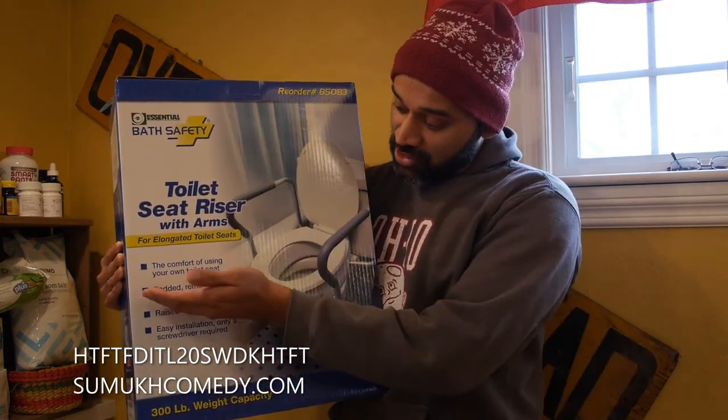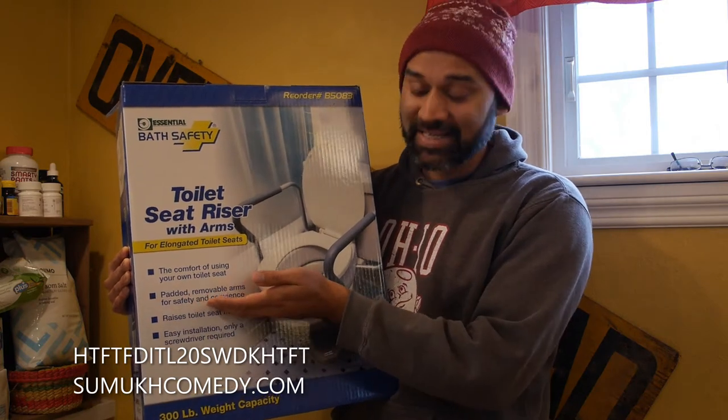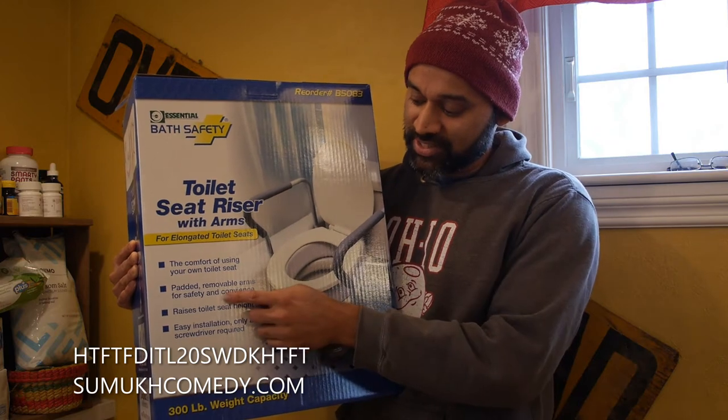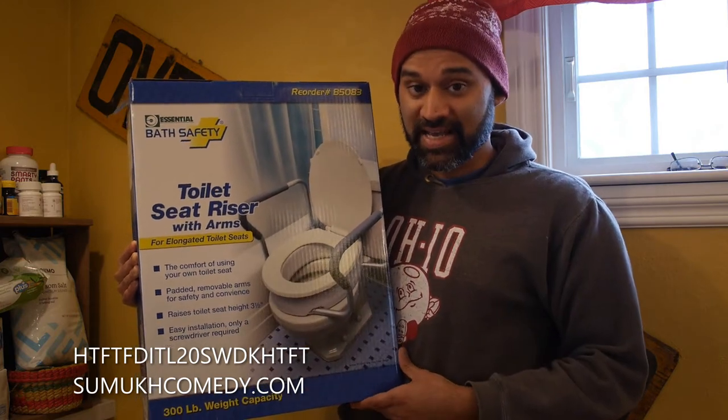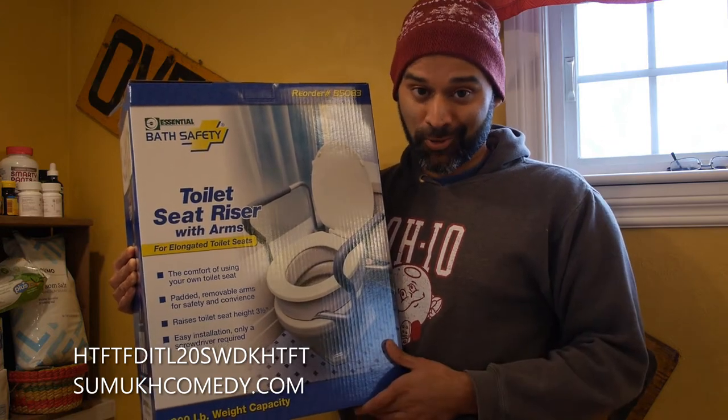As you can see, this is also padded and has removable arms for safety and convenience. But they seem to have spelled convenience C-O-N-V-I-E-N-C-E. I guess it's so convenient that you don't need a couple letters in the word.